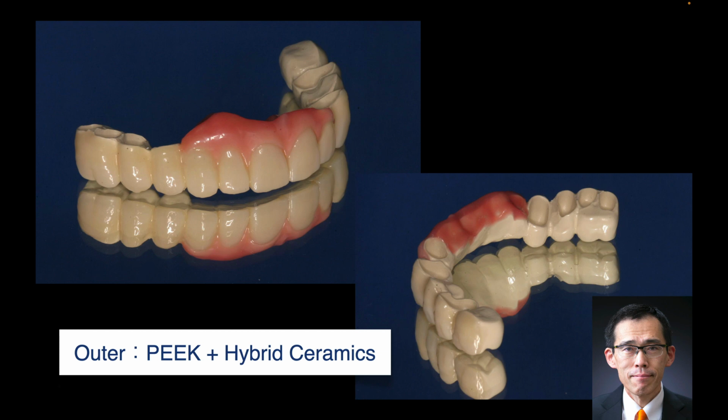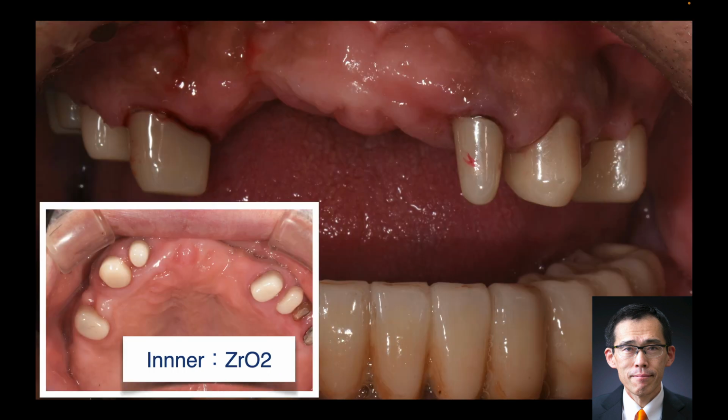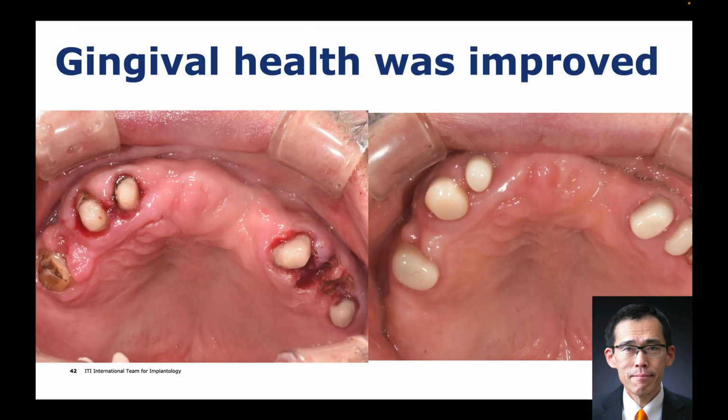The framework was veneered with hybrid resin, hybrid ceramics, Shofu. And this is the definitive restoration in these three models. You can see the oral conditions.